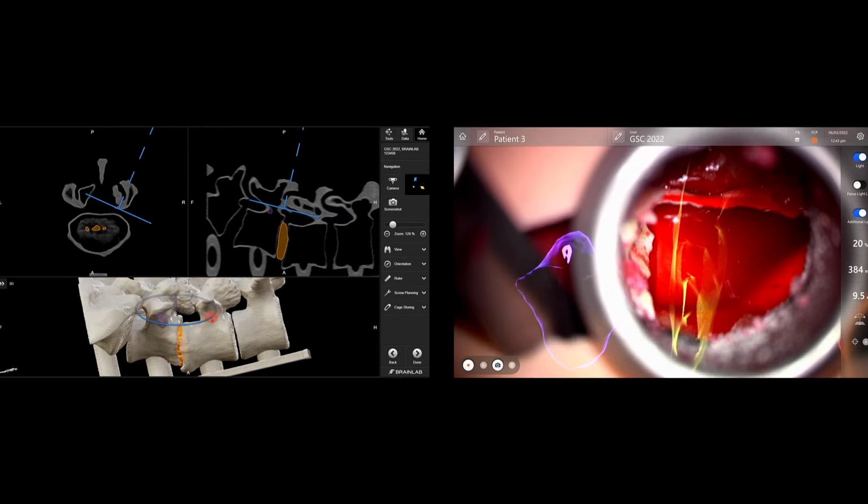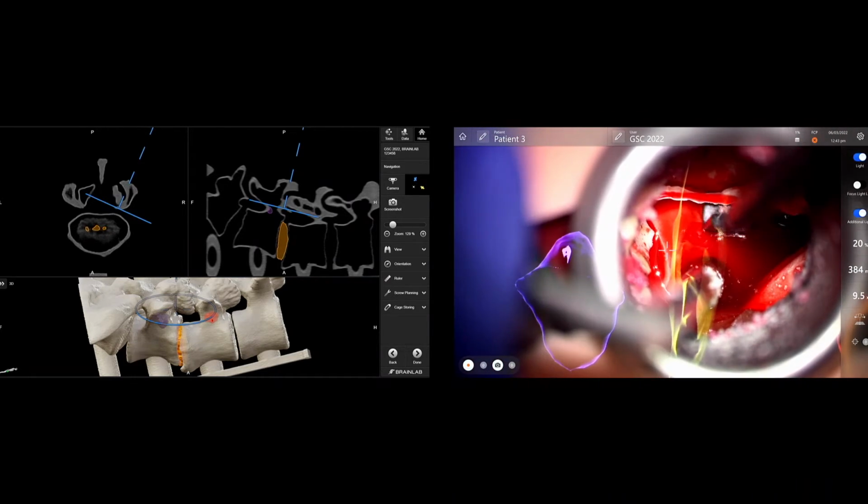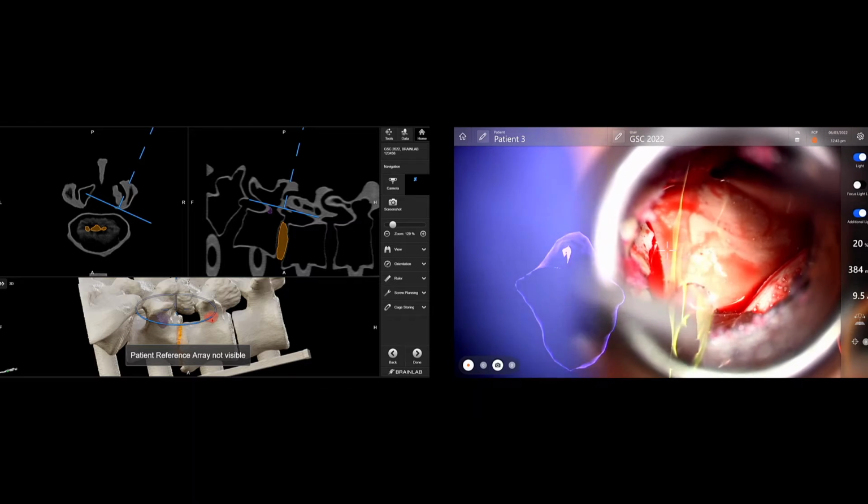We had one here. Yeah, so I'll place that if you can stand here without obstructing the view. Can you hold this here?